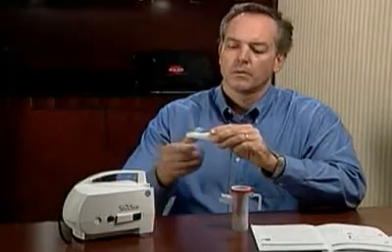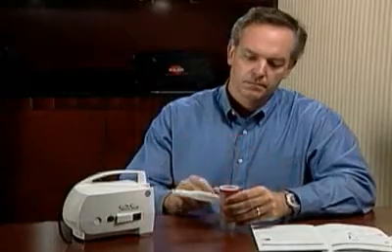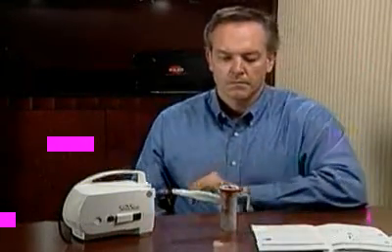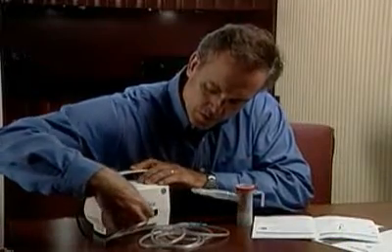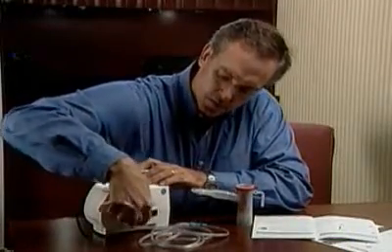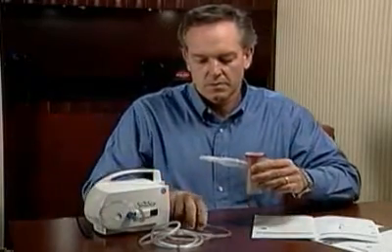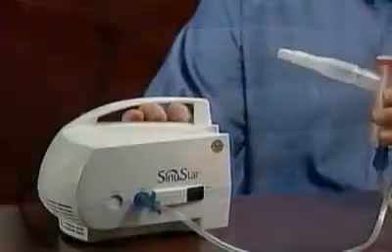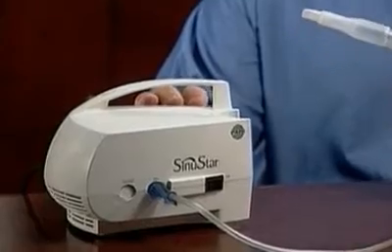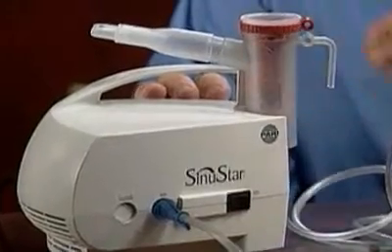Connect the nasal adapter to the mouthpiece and insert into the end of the nebulizer outlet as shown. Be sure that the top valve is attached to the nebulizer insert — this is designed to fit snugly. Attach one end of the wingtip tubing to the air outlet on the compressor and press to make sure it is firmly attached. Attach the other end of the wingtip tubing to the air intake located on the bottom of the nebulizer with a slight twist. You'll notice the compressor has a convenient holder for the nebulizer, which will keep it upright even when the tubing has been attached.